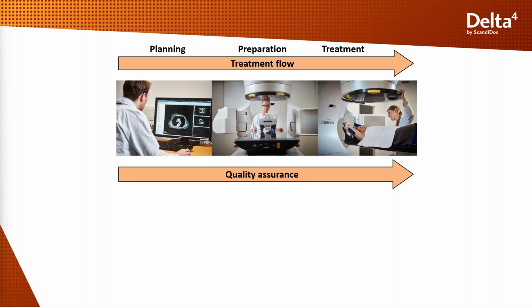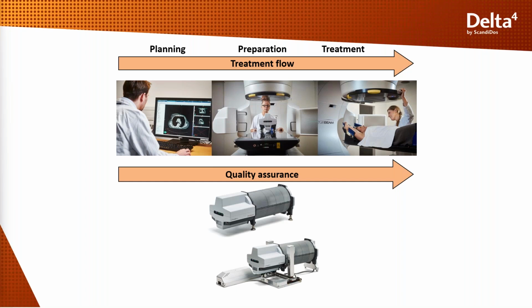Well, today you are probably already doing pre-treatment plan verification using a QA device such as the Delta4 Phantom Plus, or even motion management with the Hexamotion. Some of you are also measuring in vivo using a device such as the Delta4 Discover, and by these you are checking the plan delivery.